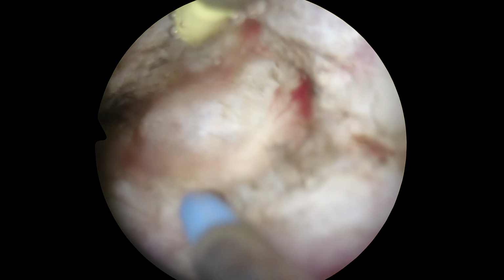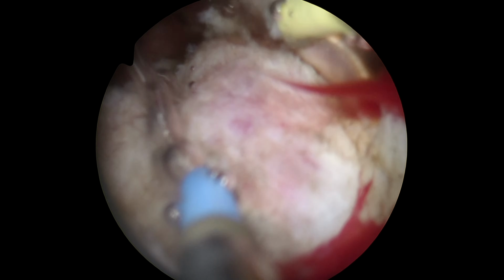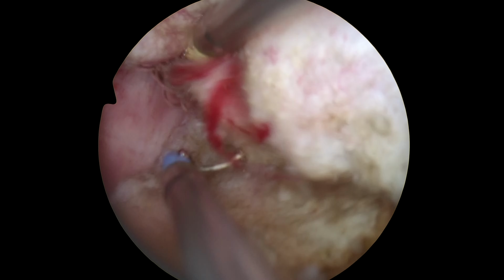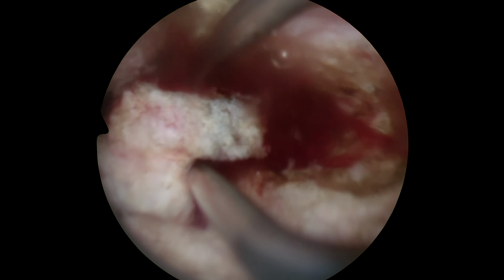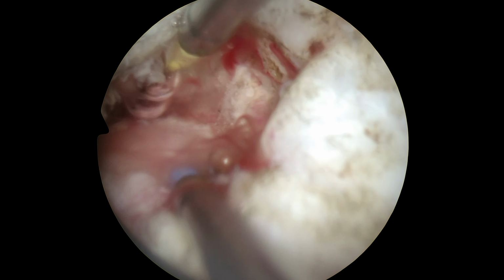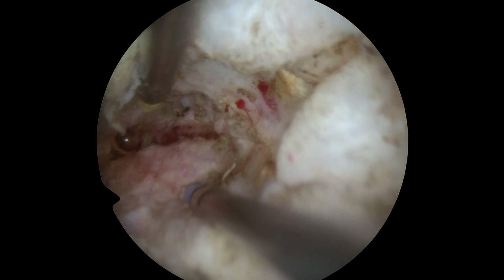I reach the pedicle of the fibroid, which is in the left half of the uterus, but for a safer cut, I'm going to continue the resection from left to right. Later you will see. Left to right in the left half of the fibroid. And of course, I will completely separate the right half.